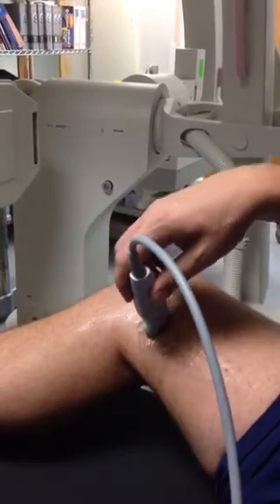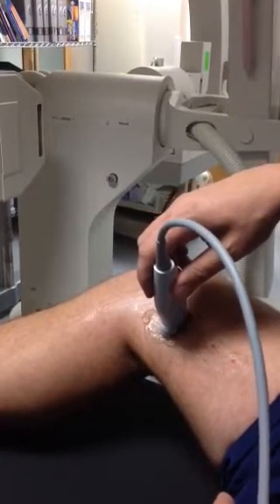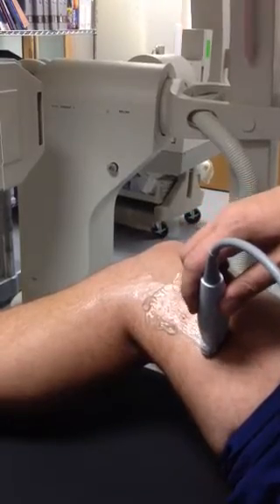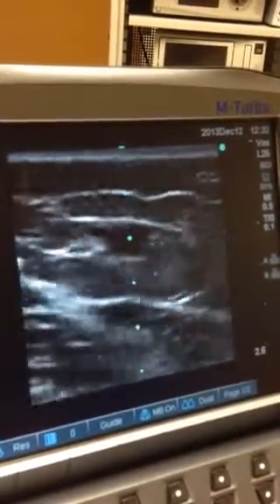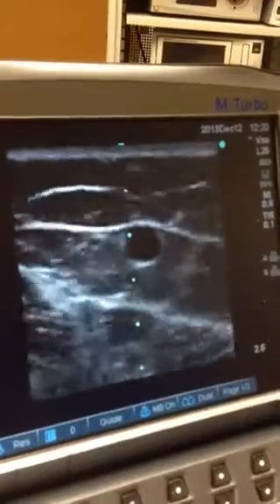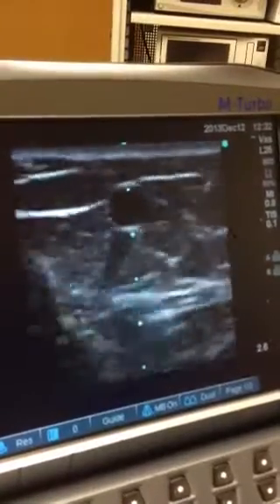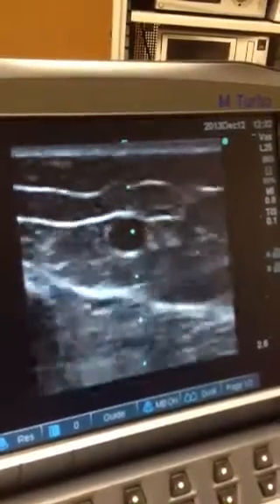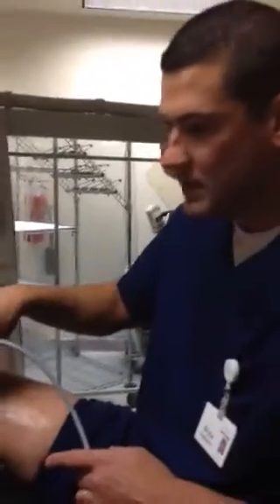Once you find it, keep it in the center of the screen. As I work the probe up and down the leg, you'll see I can follow it all the way up, with side branches coming in and out, and changes in the muscle and tissue layers of the leg. Keeping the probe in the same spot and running it up and down the leg, I can confirm the size and make sure there are no anomalies to the anatomy of the vein. That's a basic overview — you can also continue down the lower leg following from where you started on the upper leg.